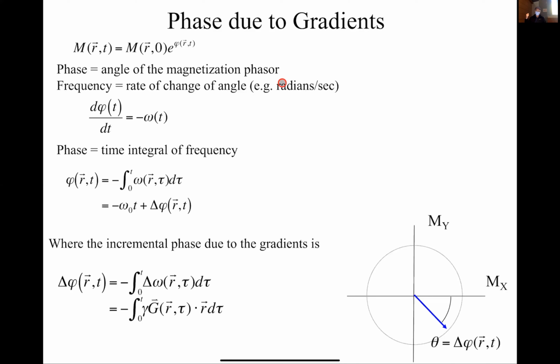All right. So what that means is we have things in terms of frequency, but now we need to convert that into phase, and phase as a function of location, because that's what really matters for the Fourier transform. It's the phase at every location that comes into that complex phasor pattern. So this is how we do it. We go back and realize that the change in phase is proportional to my frequency.